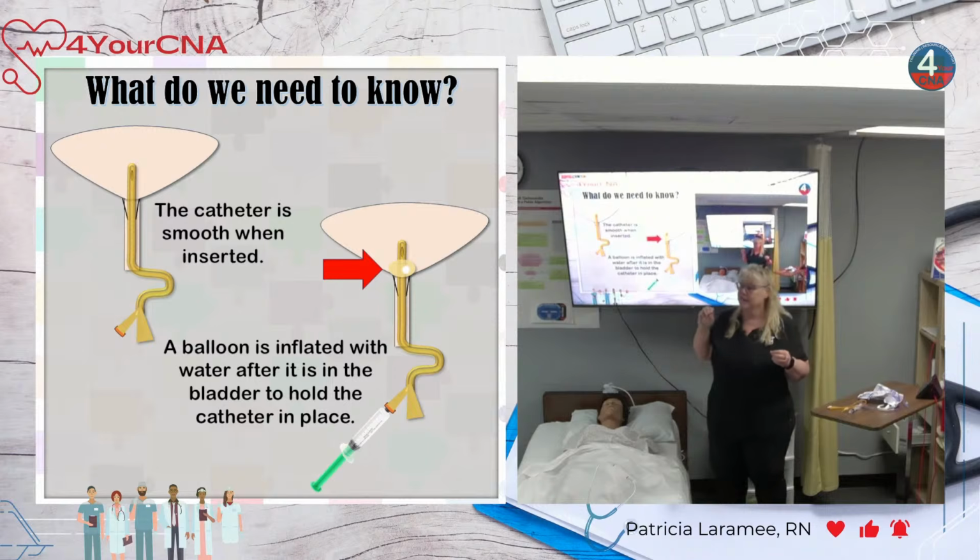And this is a don't walk, run to the nurse situation because we want to get that patient out of pain pretty quick. Okay, easiest way, remove that catheter. Remove the source of the problem. But that's going to be a problem, though. It's going to be a big problem if my patient needs the catheter. So I may have to come up with some other options.